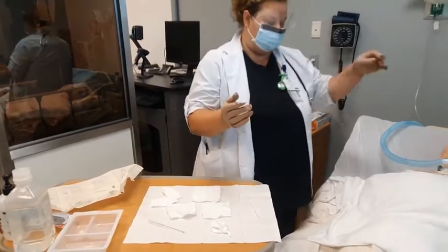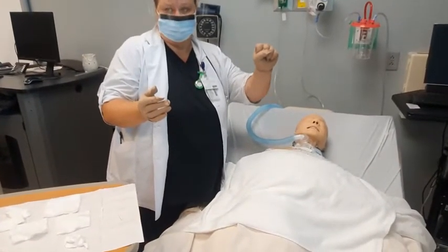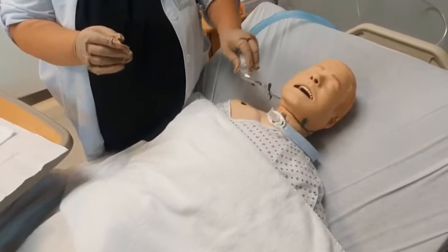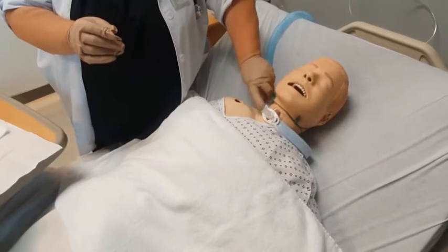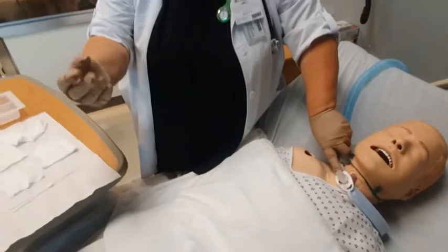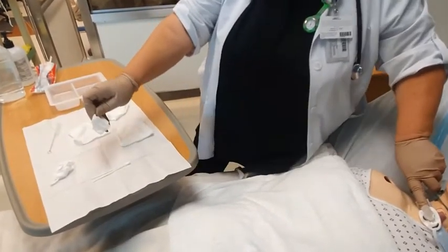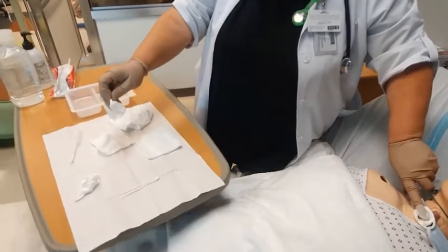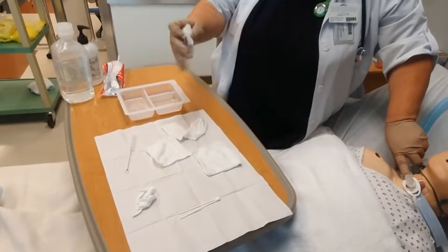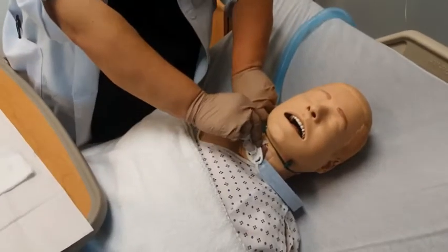So at this time, the patient does have an oxygen apparatus, so this hand is no longer going to be sterile. You're going to have to remove the oxygen apparatus. You will hold the finger on the phalanges. You will then take with your sterile hand the gauze. And so you don't contaminate, you will bring your table closer to you this way, okay?